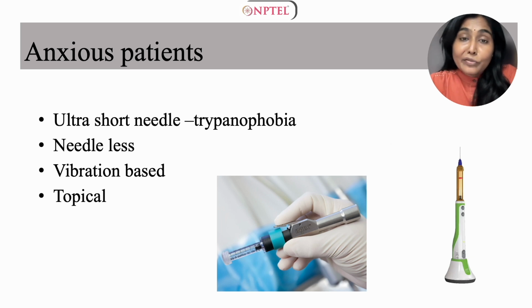Anxious patients form another subset of patient population that we would come across, and the anxiety is predominantly due to the needles. So let's try to reduce that by using ultra short needles. Needleless is much better, and use vibration based techniques to distract their focus from the pain. And let's always use topical anesthetics before beginning to use the injection anesthetic.